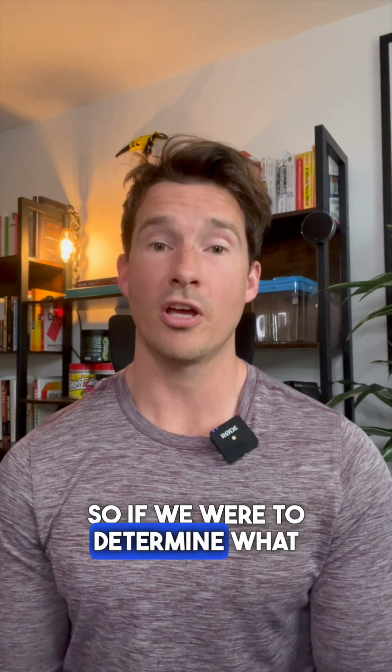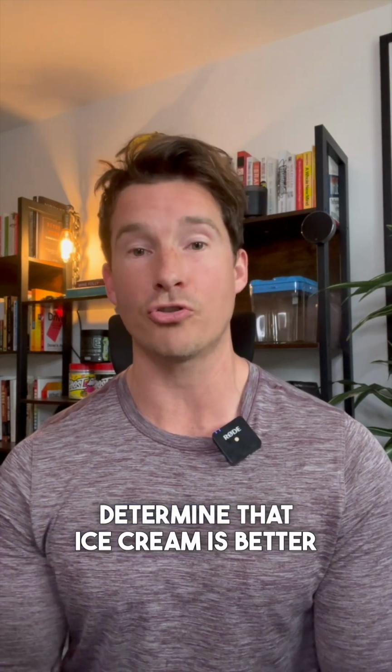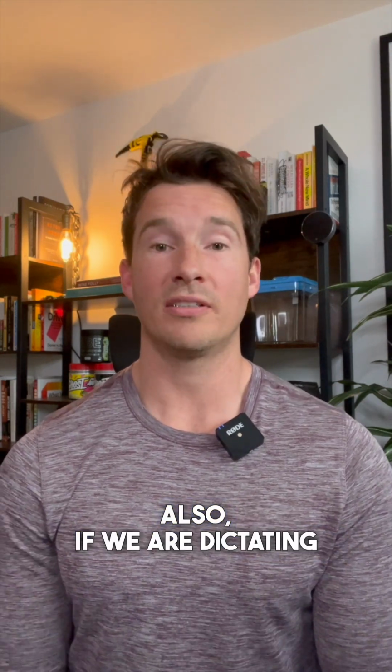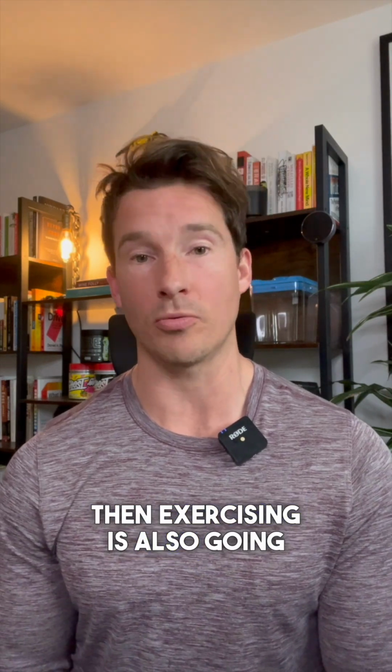So if we were to determine what foods are good or bad based on our blood sugar, we are going to determine that ice cream is better for us than a carrot, which we know is complete nonsense. Also, if we are dictating what is good for us based on our blood sugar, then exercising is also going to be seen as bad.